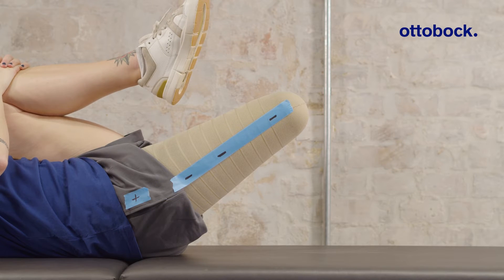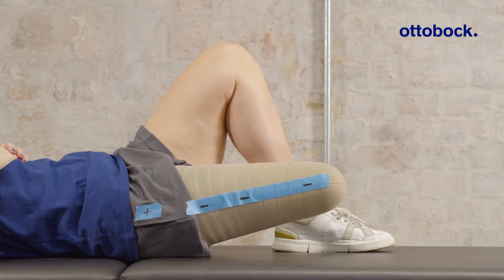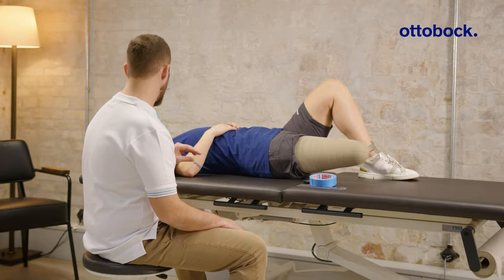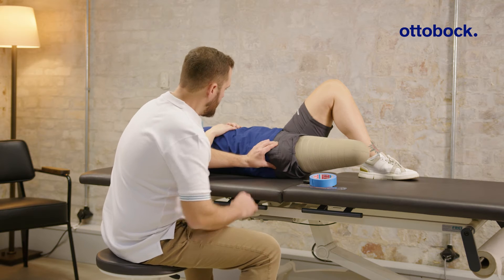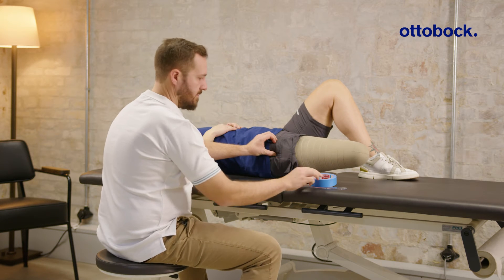The residual limb is unable to achieve full extension when there is a hip flexion contracture. Here we use the Thomas test to measure the angle at which compensatory movements become necessary to manage this limitation.